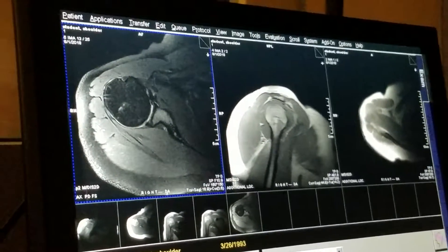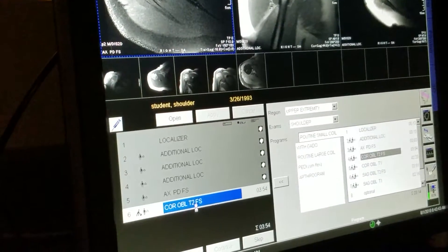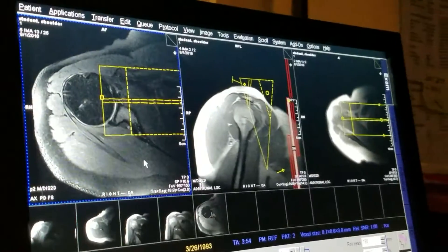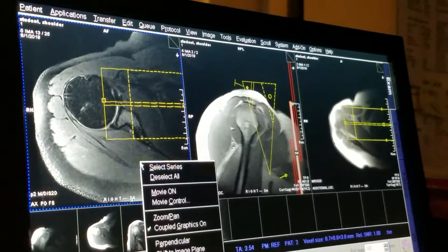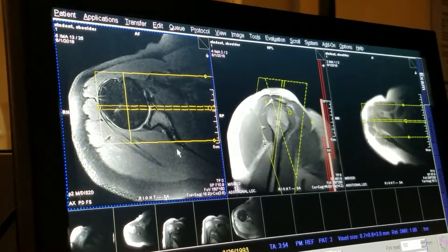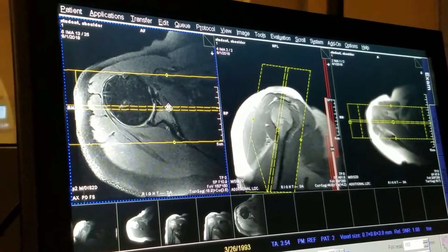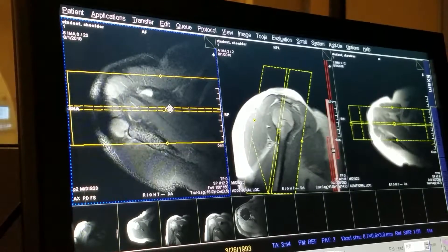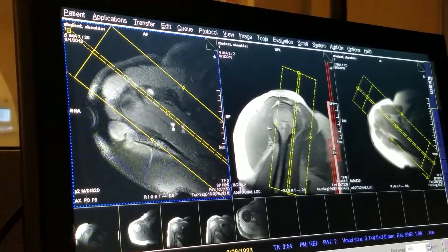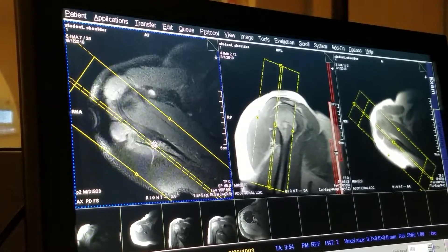Next, we're going to position for our first coronal oblique. Bring over our coronal oblique and open it up. Right off the bat, I'm going to hit right mouse click — let me shut that off — I'm going to hit right mouse click perpendicular. So I'm now perpendicular to my axial image. Bring it over, come up to my supraspinatus tendon, and we will angle parallel with the supraspinatus tendon.